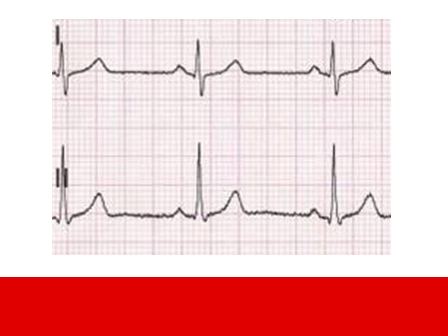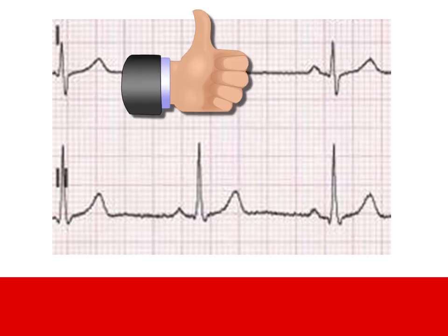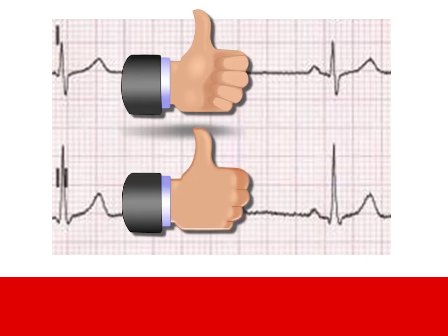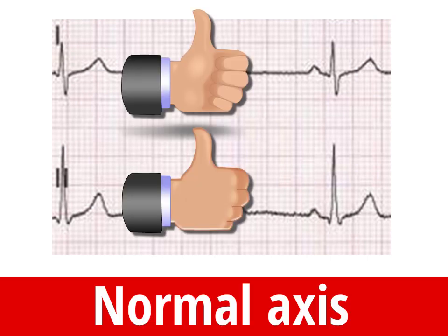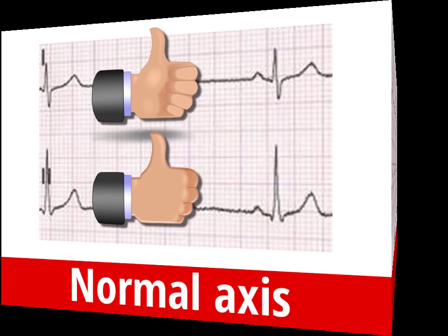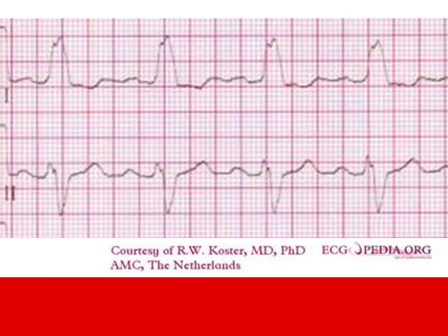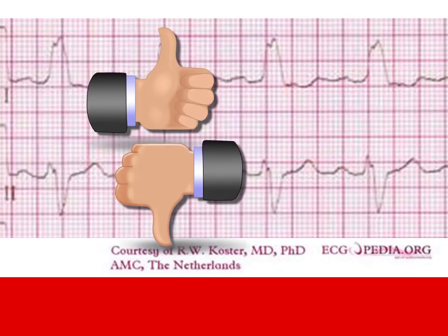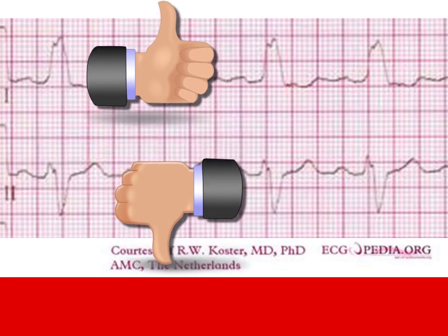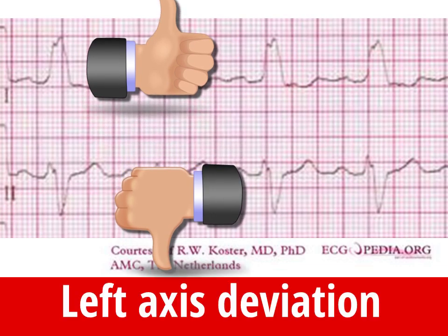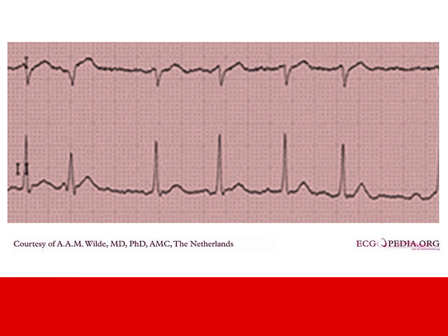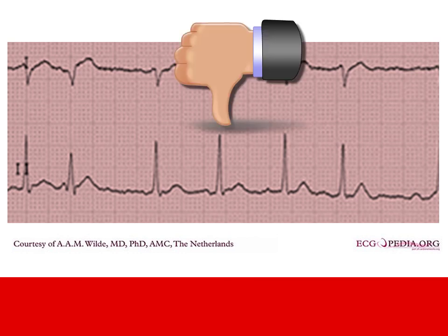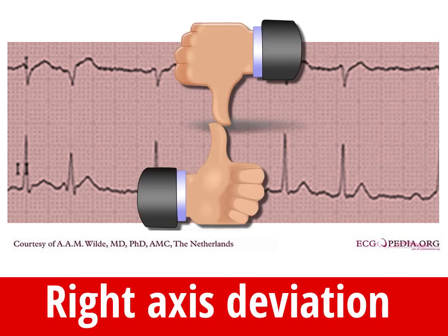Let's try that again. In this ECG, there's two thumbs up so the axis is normal. In this ECG, thumbs have left each other so it's left axis deviation. And finally, in this ECG, thumbs are headed right for each other so it's right axis deviation.